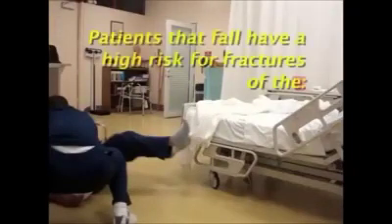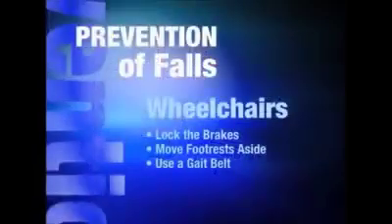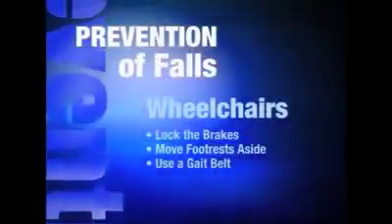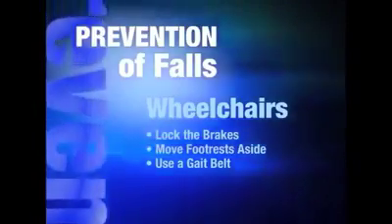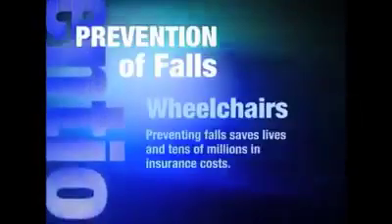Serious injuries could be the result from falls caused by rollaway wheelchairs. Patients that fall have a high risk for fractures of the hips, arms, ribs, or skull. Before transferring a patient to a stretcher or wheelchair, make sure that you have the wheels locked and the footrests are cleared and out of the way to prevent falls.